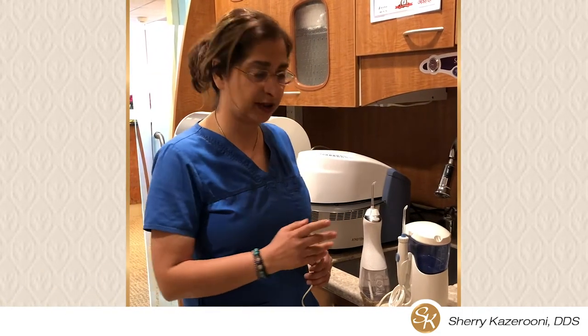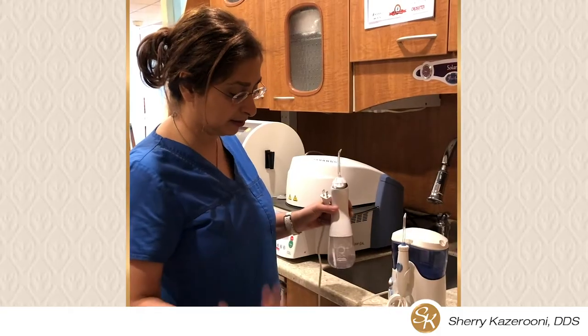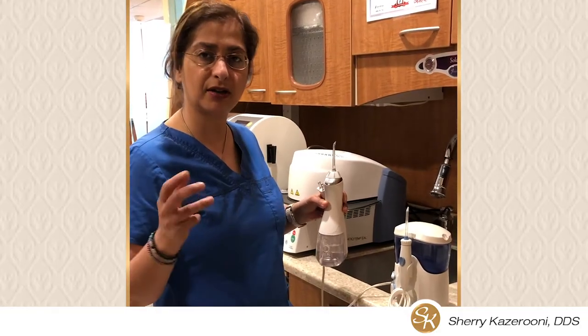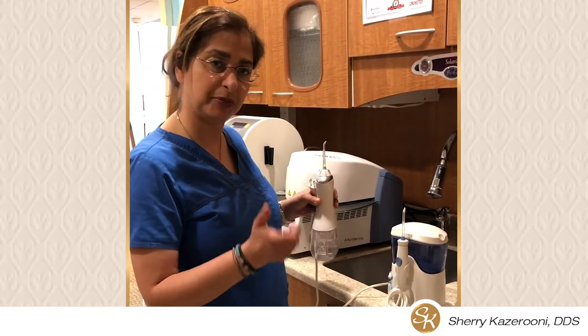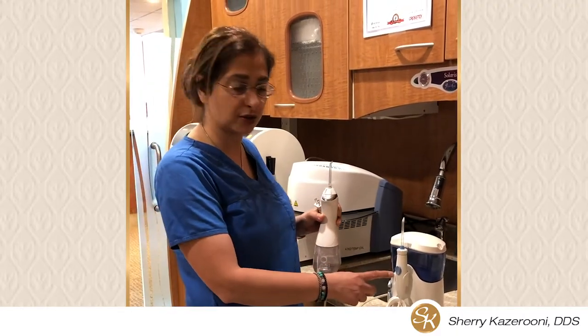Good morning. I just wanted to go over the different types of water pick and let the public know. There are three different types of water pick in the market. Costco has a combination of two of them — a big and a smaller one. This is a portable one, but it does not have the strength of the larger one.